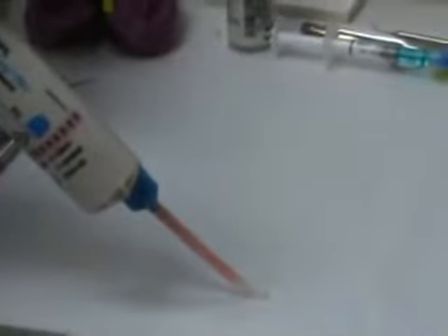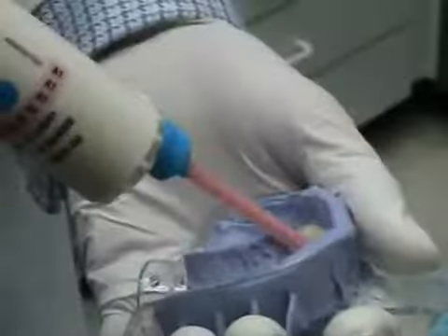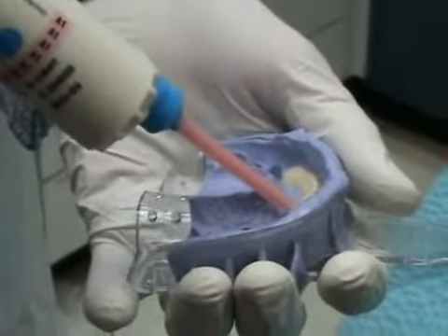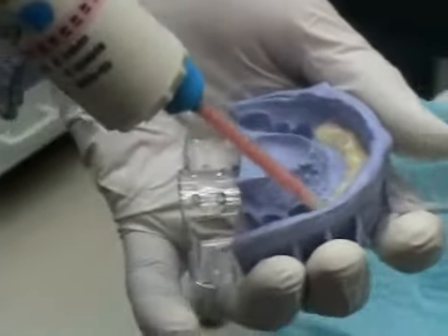Place a new mixing tip on the Garant dispenser and bleed a small pea-sized amount of paste to ensure proper mixing. Next, load the matrix with ProTemp Plus by filling relevant spaces from the bottom up. The completion of this step should occur at around the 40-second mark from the onset of mixing.